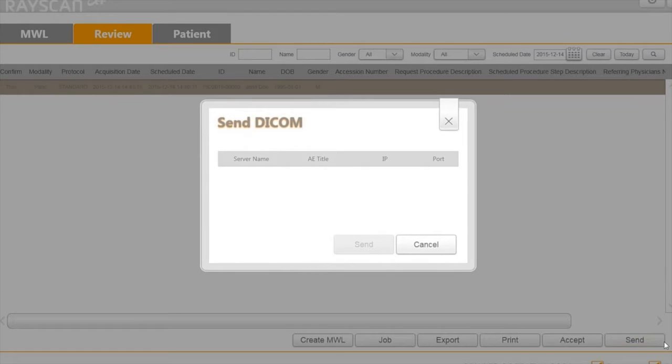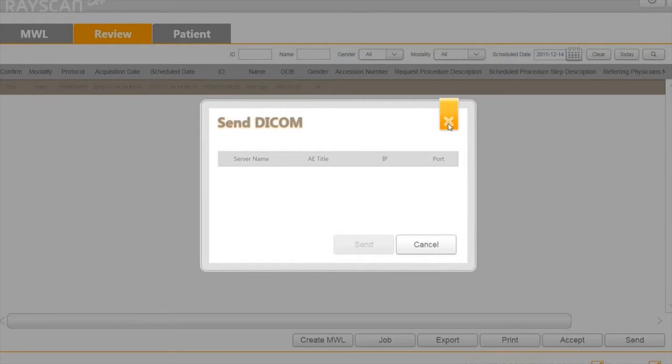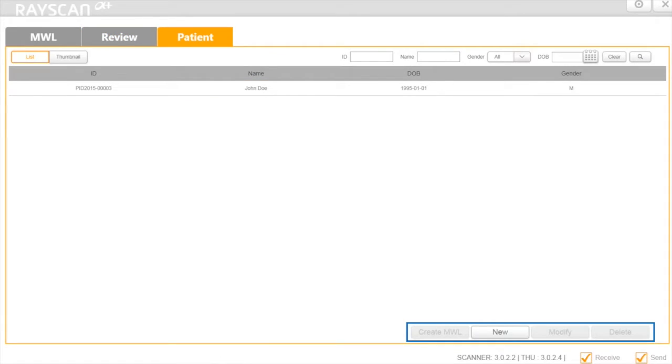RayScan provides DICOM sending, so you can select an image and send it to the PACS system.